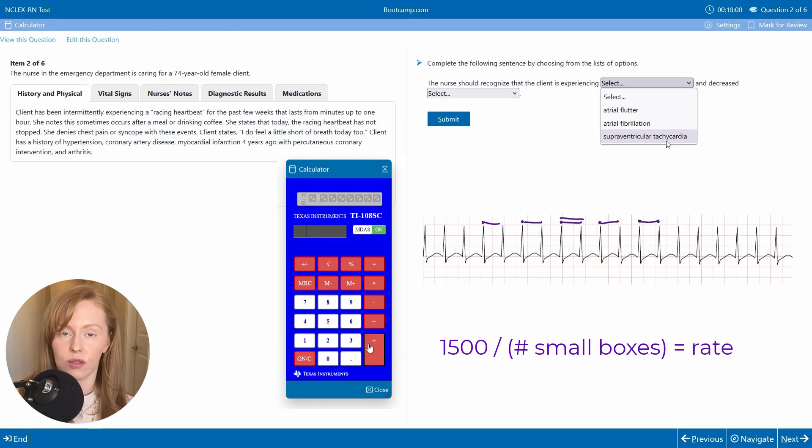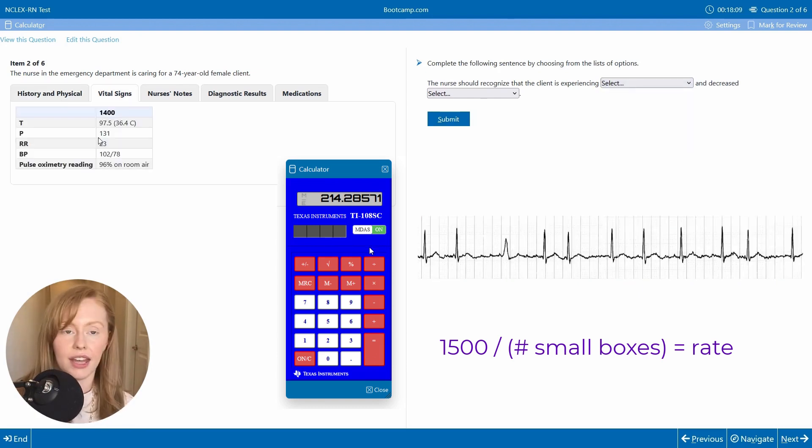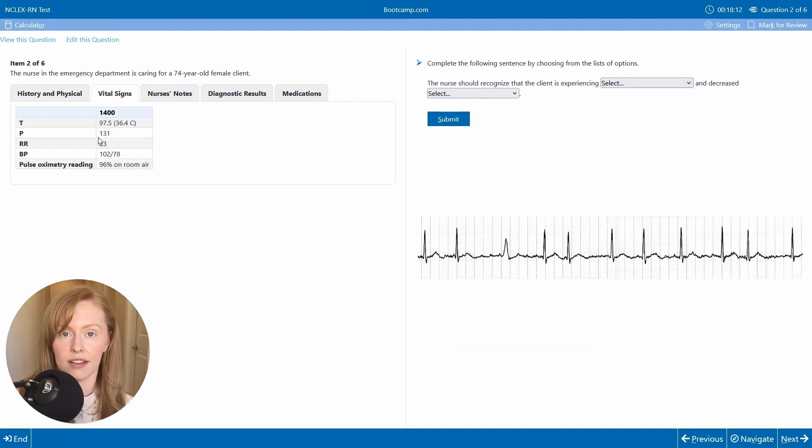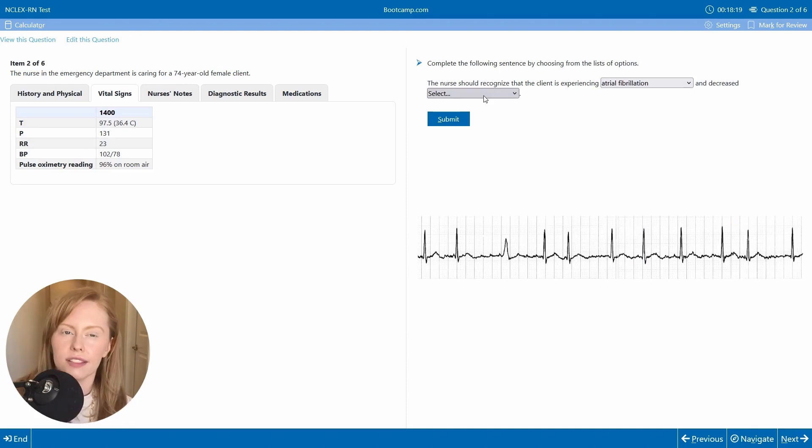So that puts this at a rate of about 215. And so far, this meets all the elements of atrial fibrillation. Now, how is this affecting my hemodynamics?